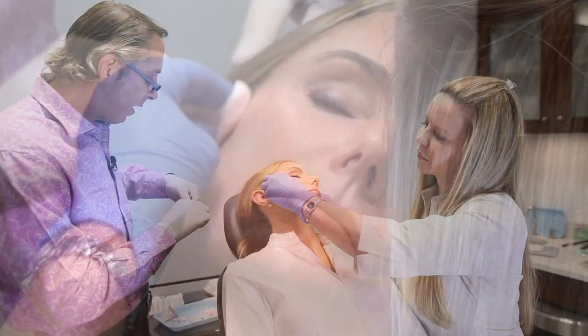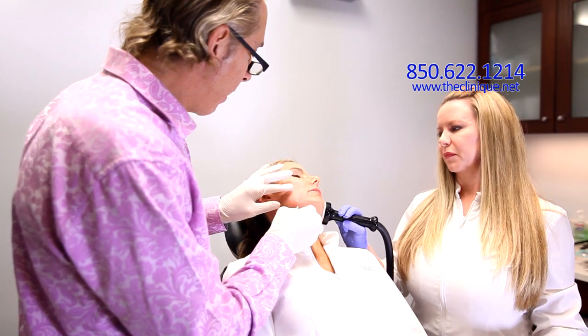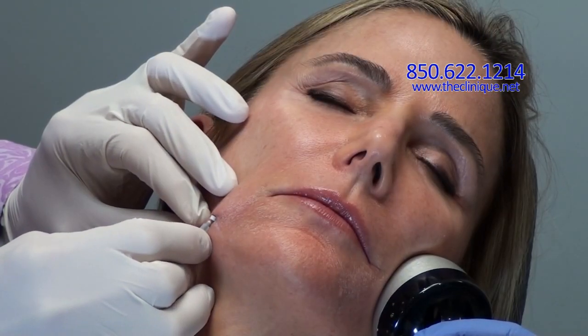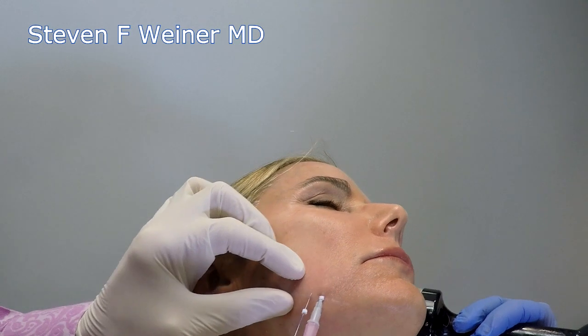Now I'm going to do the smooth threads. I'm going to do these in a crisscross fashion like I told you, right in here. Okay, this is for the crepey skin in the cheek area. And so this is smooth. So it doesn't have any barbs on it.